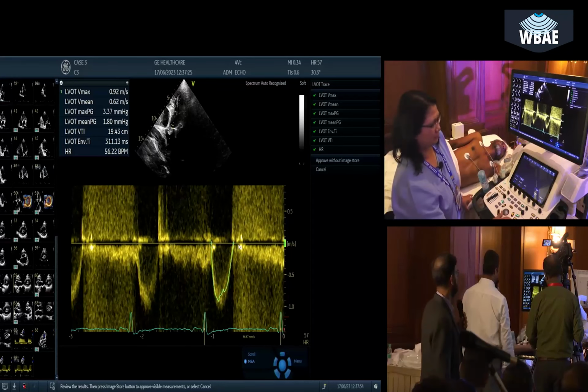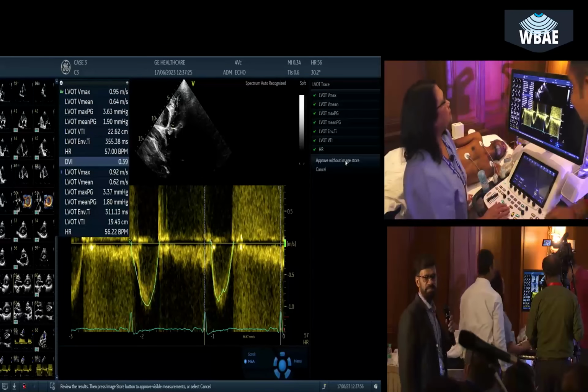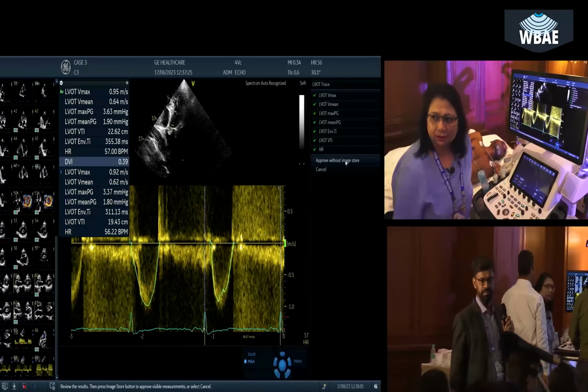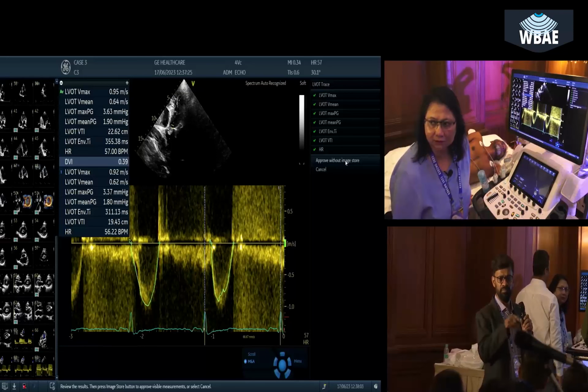And let's have the aortic valve VTI. That was 50. That was on CW. You want to take that or you want to have a PW? That 20 divided by 50. But would you like to have PW at the aortic valve?